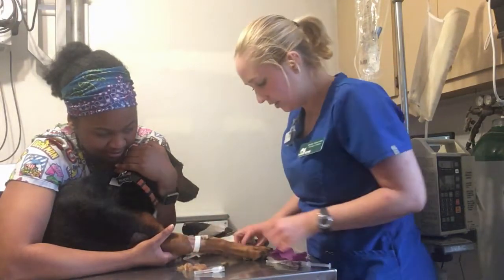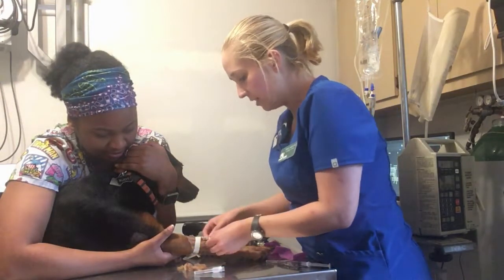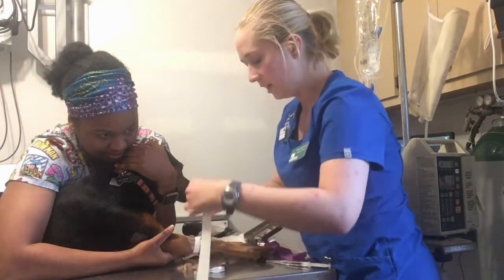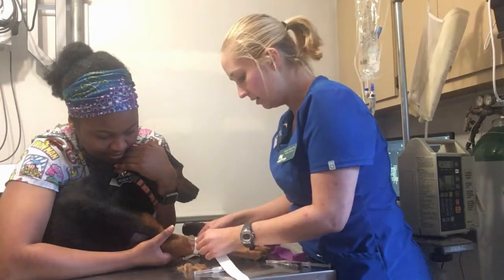After that, you're going to take a 2-inch piece of gauze and put that underneath the plug. And then you're going to take your inch tape and tape that.